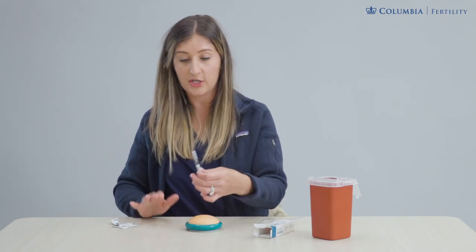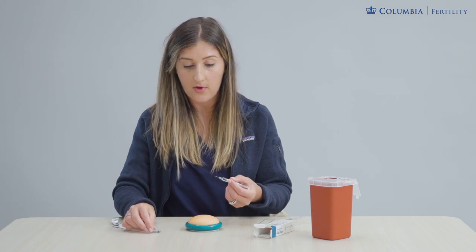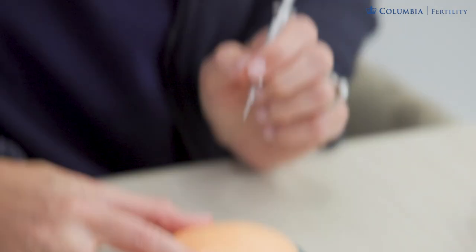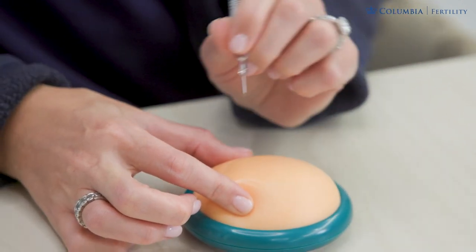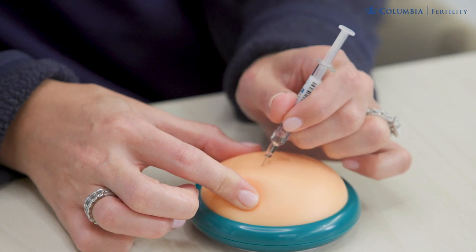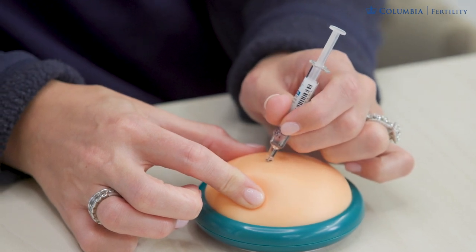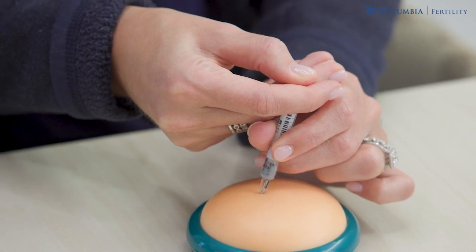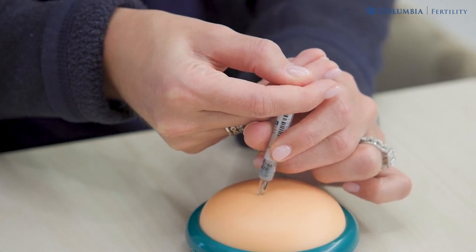Then I'm going to do my injection. I'm taking that cap off, holding this like a pen or a dart just at the base, pinching the skin, and then at a 45 to 90 degree angle we're going to do one, two, three — the needle tip goes in. I don't see any needle. I can release that pinch hand and then push this down all the way to administer the full contents of that pre-filled syringe.